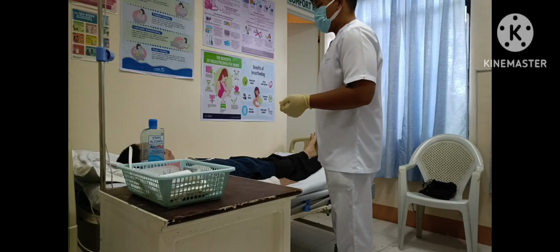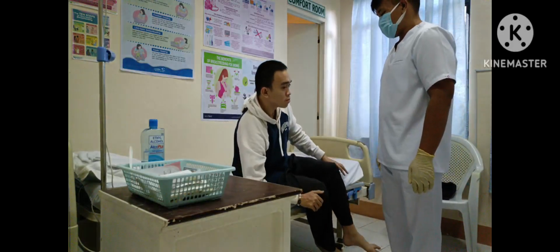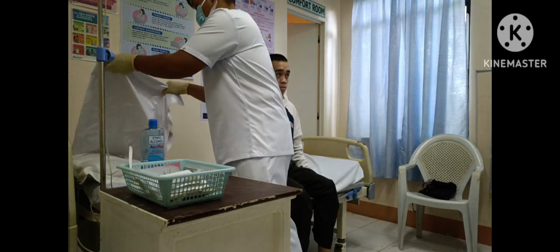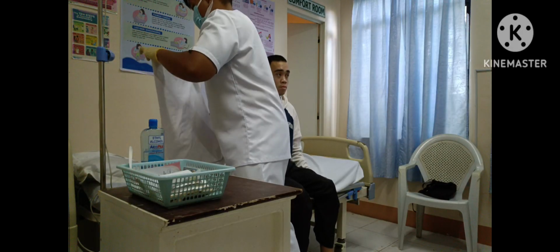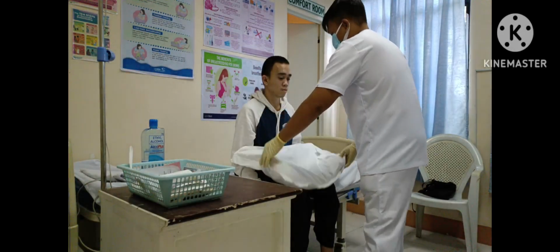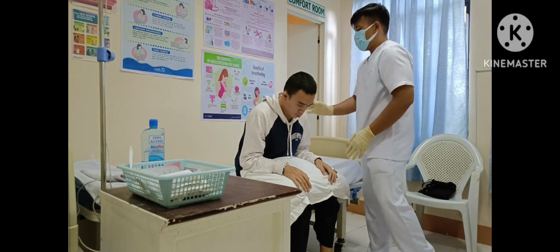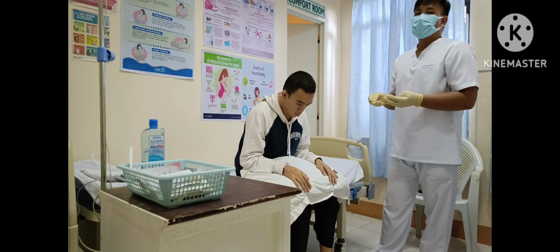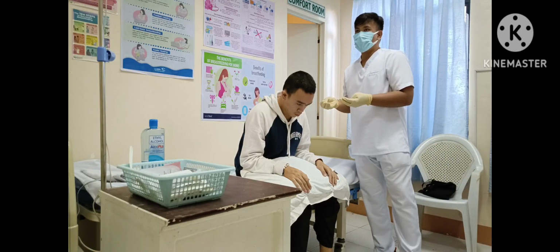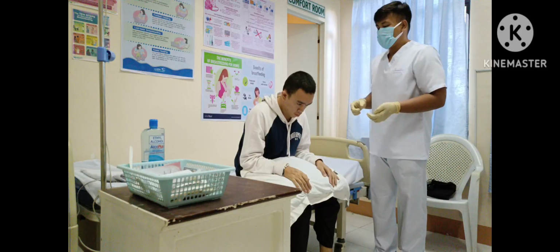Okay. So first, sir, I need you to sit on the edge of the bed. It's very important, sir. I'm just going to use this pillow. I want you to put your hands here, and then I want you to do that, sir. Now, assuming that the doctor is about to insert the injections, the first is going to inject anesthesia, and sir, this is going to hurt a little bit since the injection is quite long.